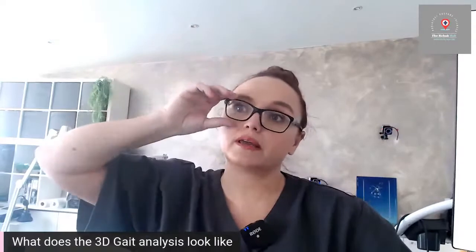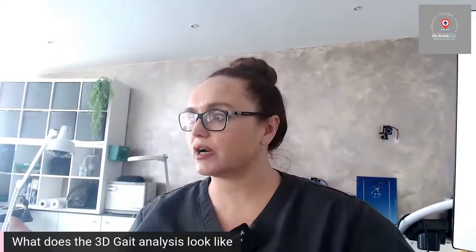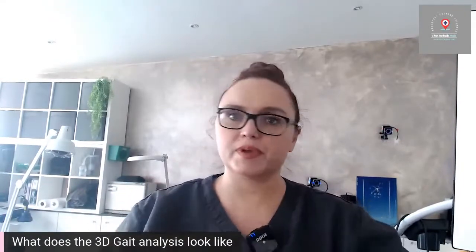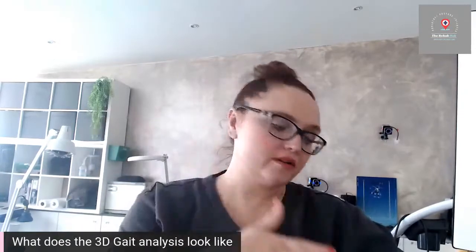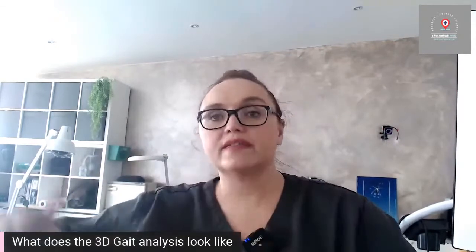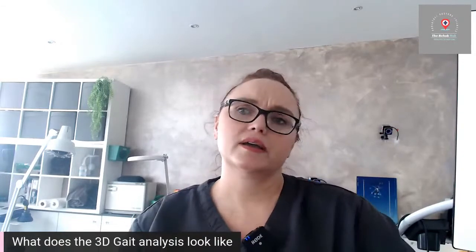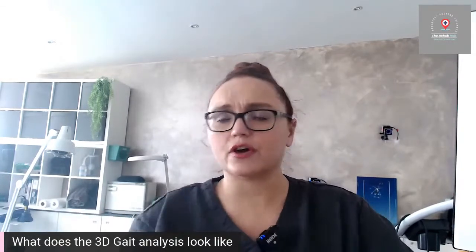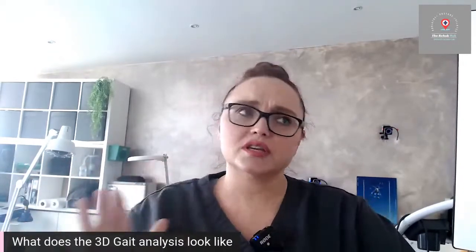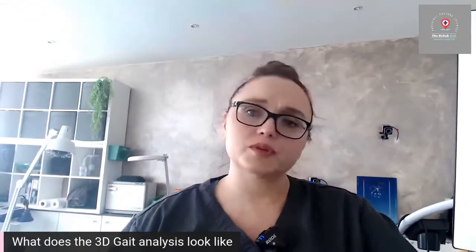So say you've got a particular injury and you want us to coach you all the way through that, we can absolutely do that too. So whether you're working with a physio, or whether you are a physio or a healthcare provider, we are more than happy to work on a referral basis where you can refer your patients in, and we would absolutely refer them back over to you with that full report of findings, with your patient's permission. So you've got that data, that absolutely thorough assessment. It's kind of like sending your patient for a movement MRI so that you can see exactly what's going on and best help them. So that's something we do quite a lot as well.